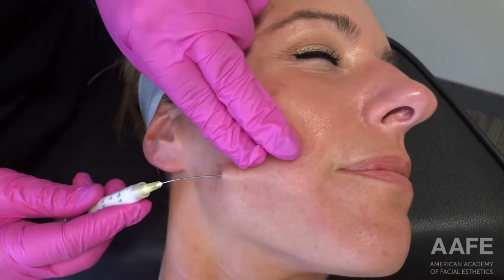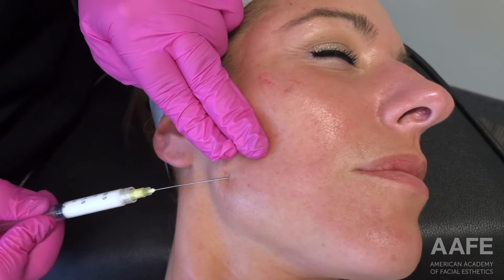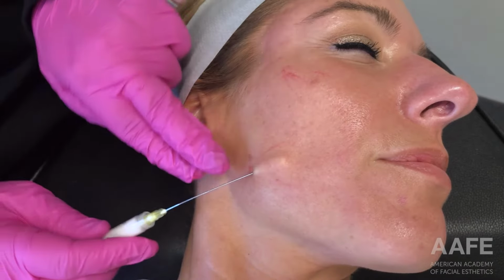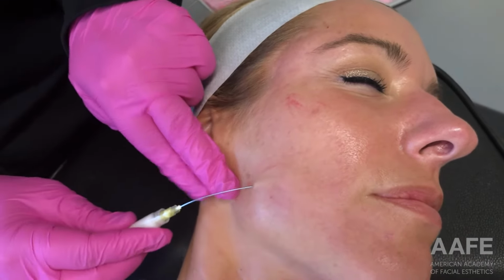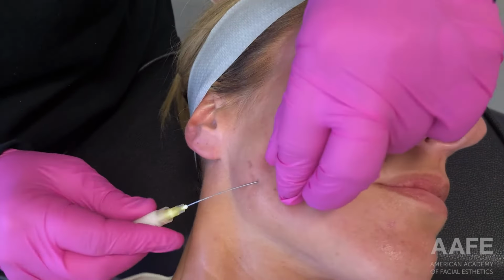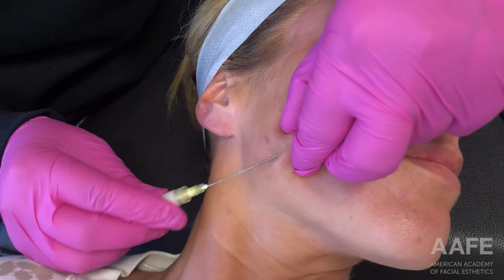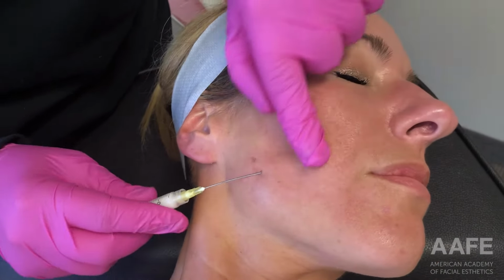So we are using the biostimulatory filler, Radiesse, in order to stimulate collagen and elastin to try and fill in these areas where she appears like she's lost some volume. In the cheeks, in the mid-face, in the jawline, overall we're looking for a nice refreshing appearance of the area, and hopefully we're going to get more volume out of this.